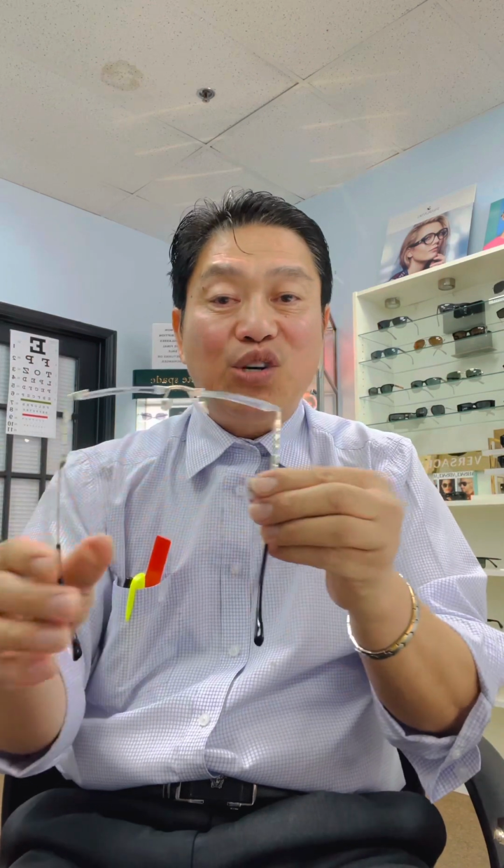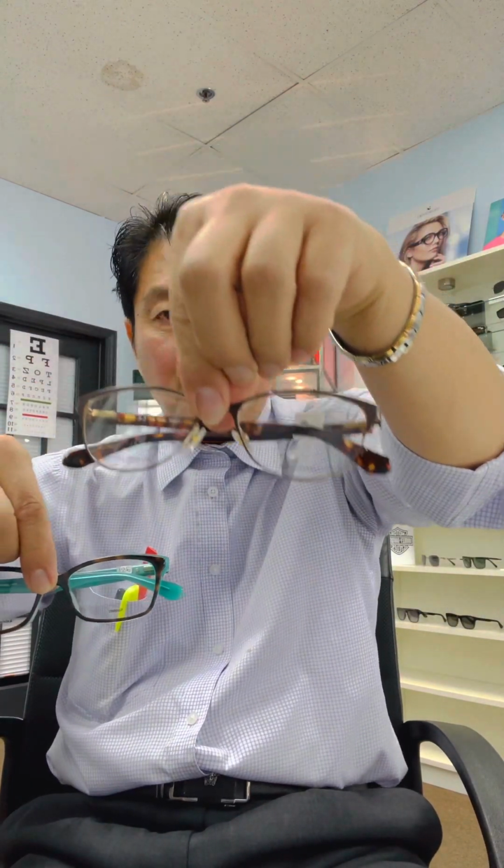Okay, so these are the designs of the frame. We call this one rimless frame. This one here, we call it semi-rimless frame. Okay, and this one here is a full plastic frame, and this one is a full metal frame. Okay, now we're gonna go to the parts of the frame.